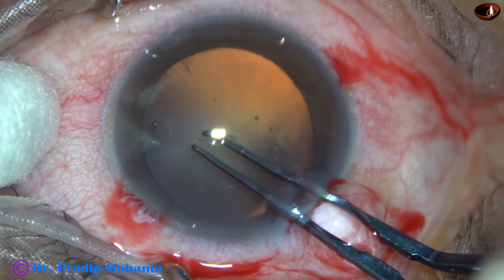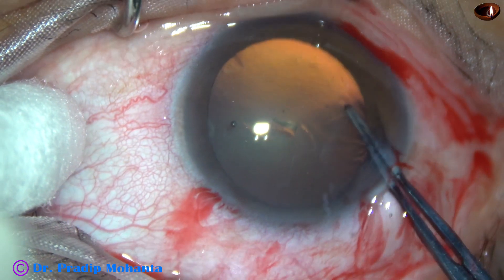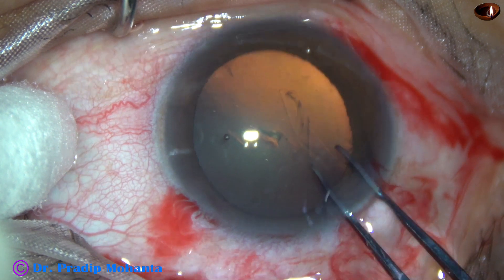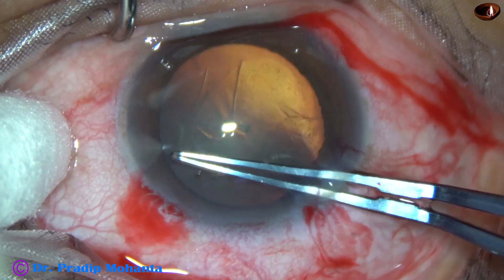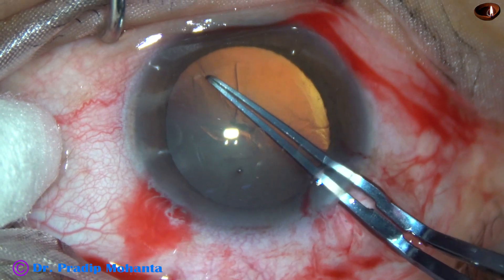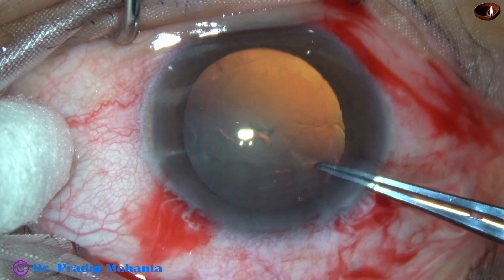After the initial steps, this is capsulorhexis with utrata forceps. The rhexis was good, about 5.5 mm, and there was no problem in this step.